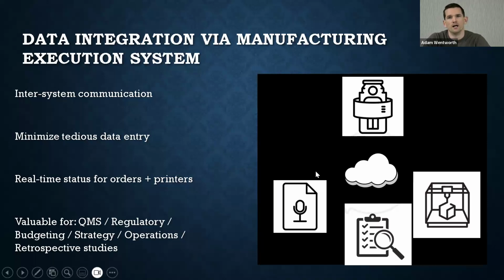Networking with printers is also enabling a lot less manual data entry through the real-time status of printing parts, through data collection on material use, printing time, and just filling in any data gaps. If you have manual data entry, you're going to end up with data gaps. And we're really hopeful that this type of system will also automate the dictation, which a lot of radiologists would appreciate, so that all the data involved in a case could automatically be put into their template and used for billing at the end of the day.